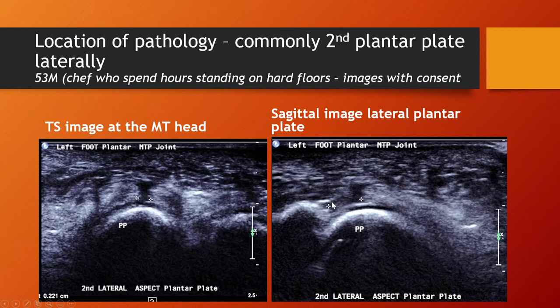And in the longitudinal we can see the length has been measured. We can see exposed cartilage, so we're seeing greater reflection from the hyaline cartilage, which helps confirm that there is a defect. The longitudinal image is labelled lateral, so we know the location and we know that it's at the distal insertion onto the proximal phalanx. And that's the really typical location.